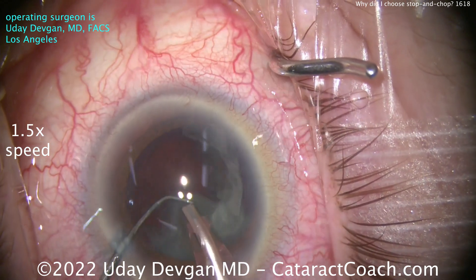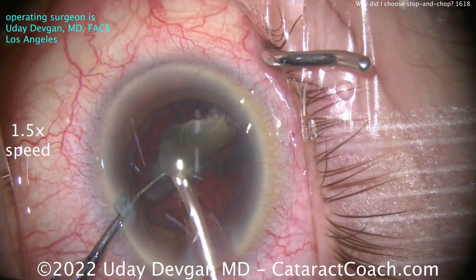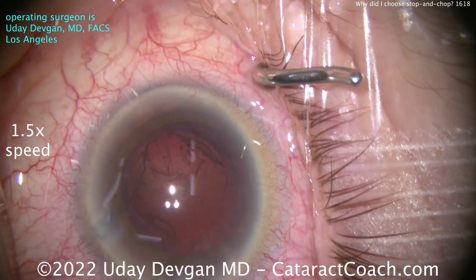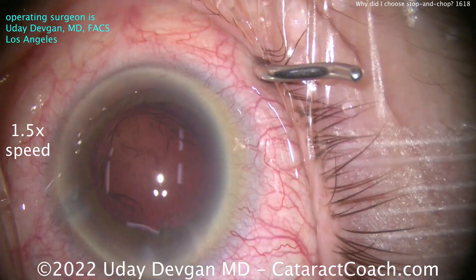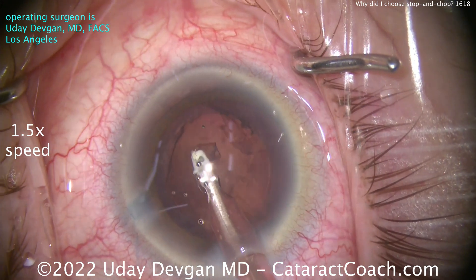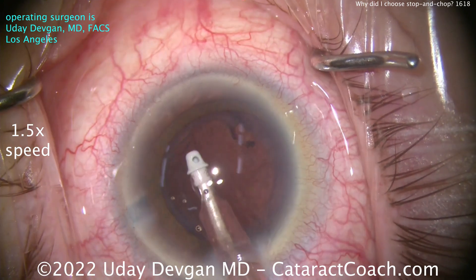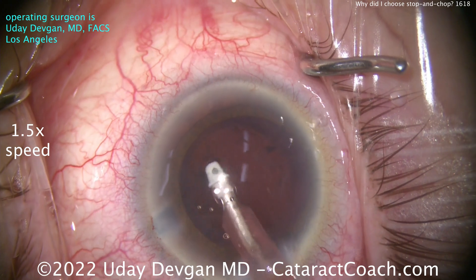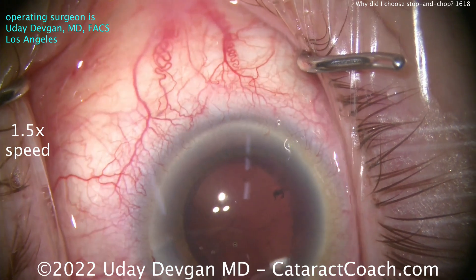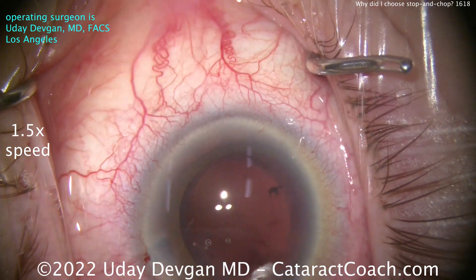I love phaco chop — I think it's my go-to, my fastball, used in almost every case. But there are cases like this where you want to be able to do other techniques, like a stop-and-chop technique. When I was teaching residents, I would always tell them: learn all the techniques, and then you can tailor what you deliver to the patient based on that patient's anatomy and the clinical situation. It's better to have more tools in your toolbox than fewer. I want to be adept at performing all different types of nucleofractis techniques. In this case, I just thought a better option would be stop-and-chop.